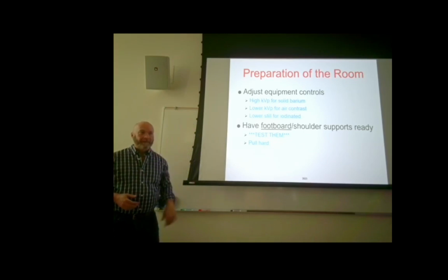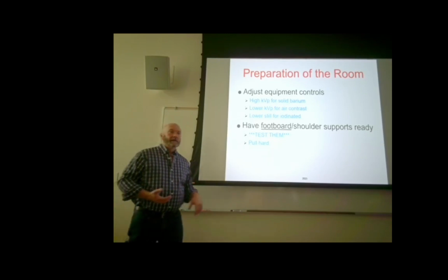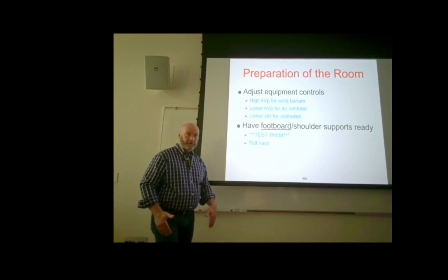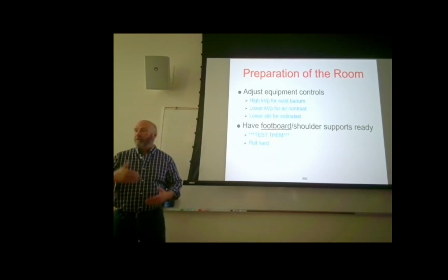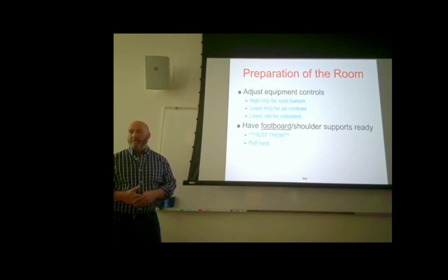It's coming off, right? And these are not healthy patients. If they were healthy patients, we wouldn't be doing GI studies, right? Their other foot may be under it, so you may drop all that weight on the patient's opposite foot, harm the patient, break a hip. You got all kinds of problems there.